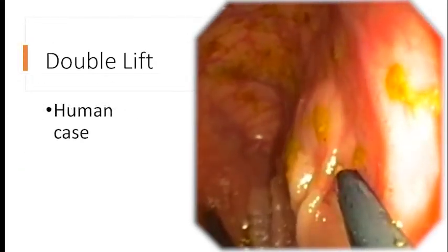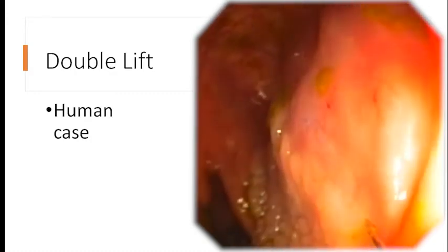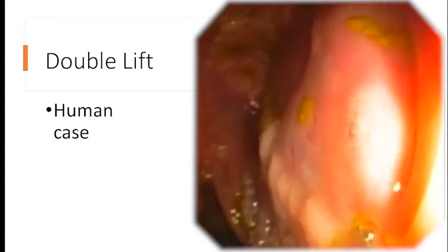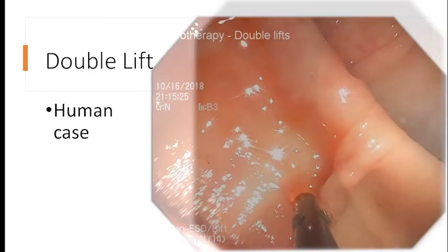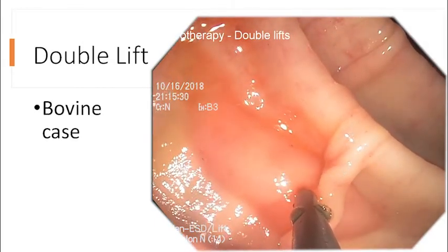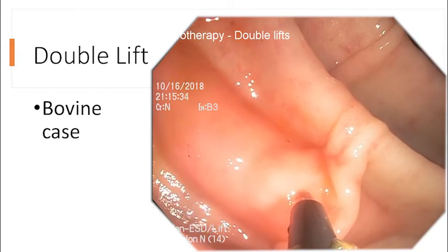This human video clip shows a lift injection being made in the rectum. A diffuse low lift is initially obtained, but later a clear-cut superficial lift starts to form. This video of a sclerotherapy needle injection shows initial deep wall expansion. As the needle is withdrawn while injecting, a superficial lift begins to form.